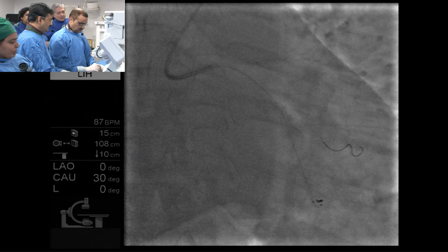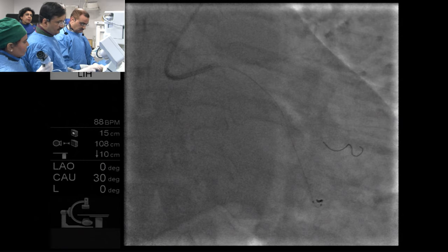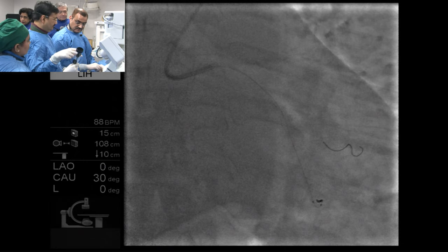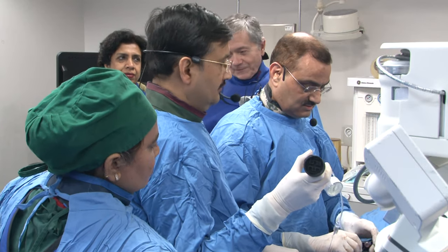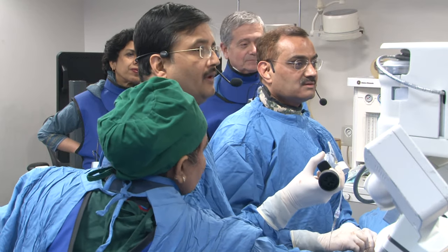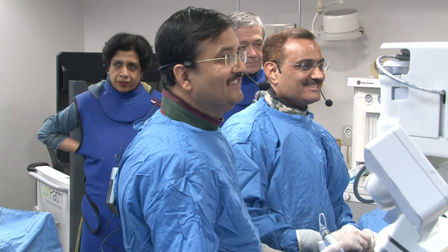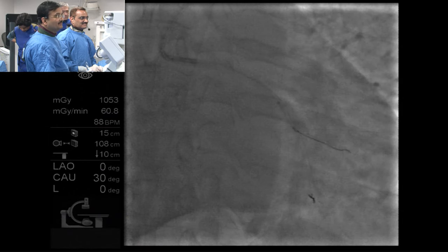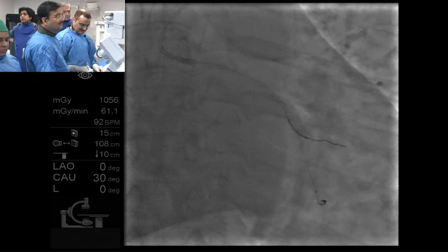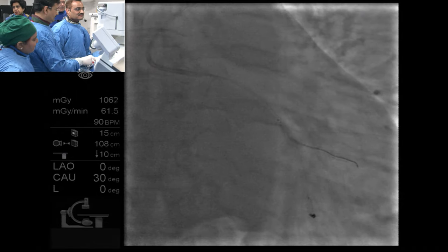Sam? Yes, John. What would you think about the idea in retrospect if you just put a cutting balloon in the ostium of that circ, so if you could get a decent balloon result and just do a provisional stent? That's what I would have done to start, yeah. Again, I'm a big believer in medical therapy, so I don't treat side branches as respectfully as many people do. There's a small study, cutting balloon side branch and main branch stenting. Very small study, 30 patients, and the result is okay. There's no major study using this idea.